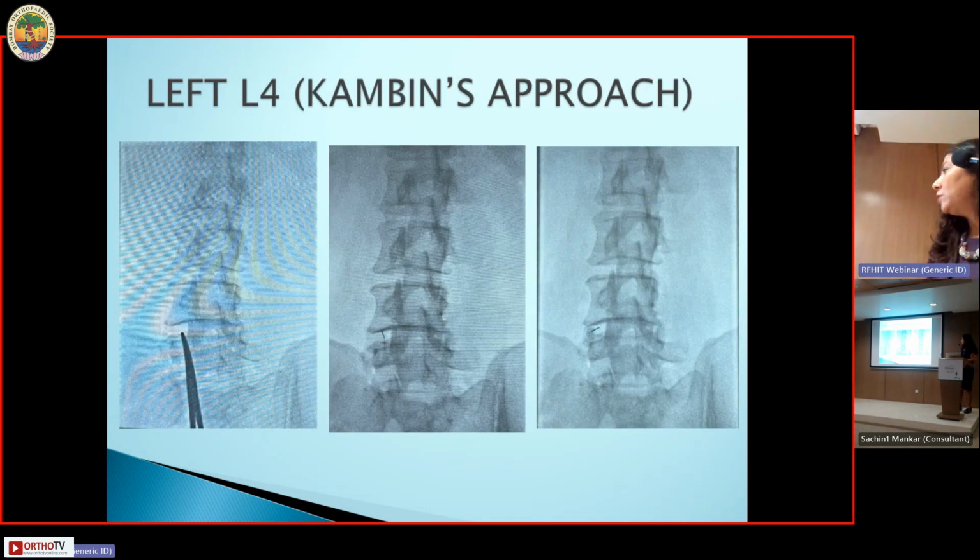So you take the spinal needle and you square the vertebrae, of course, the inferior end plate here, and you use coaxial imaging, that means you follow the beam of the C-arm. In oblique C-arm position, you follow the beam of the C-arm so that your needle is visible only as a small dot here.